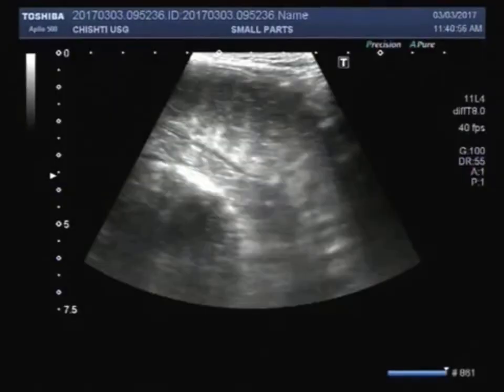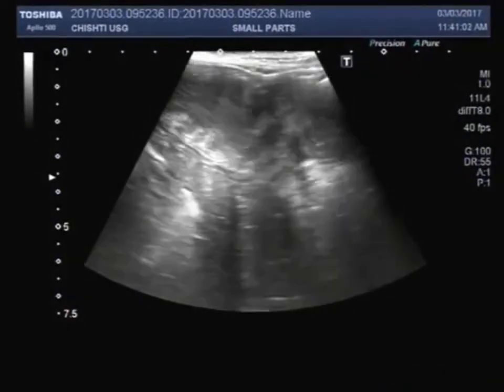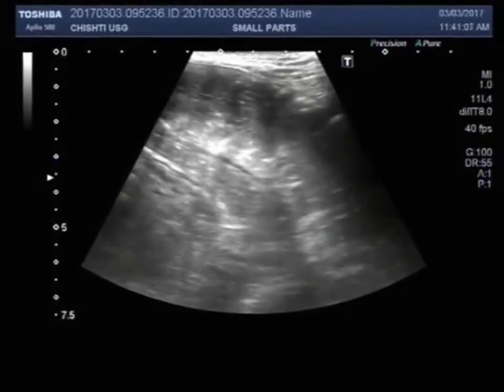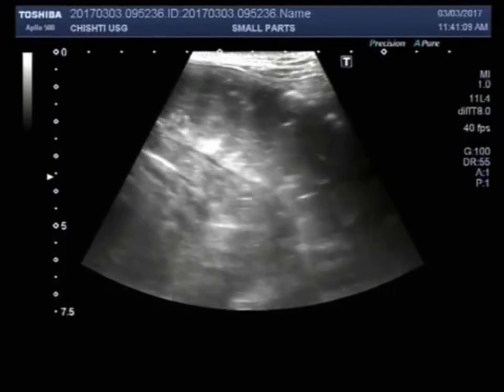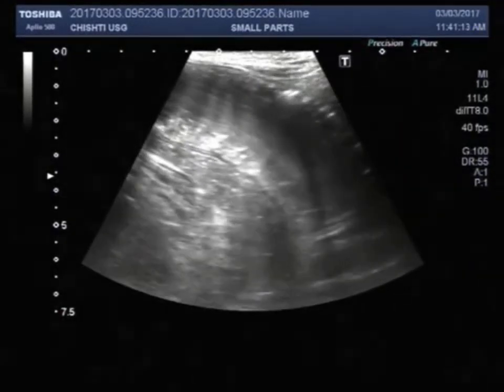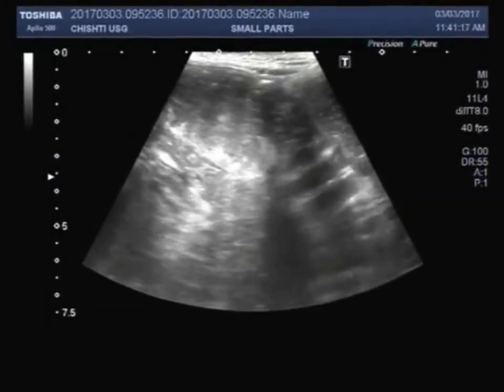And then remember our request for the ultrasound. So what happens in ultrasound? In ultrasound, in the majority of cases the abdomen is distended. Sometimes it is so full of gas that it's impossible to look inside the abdomen. But sometimes we can see the dilated bowel.